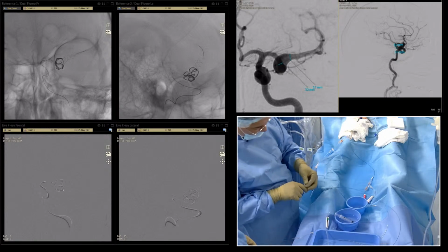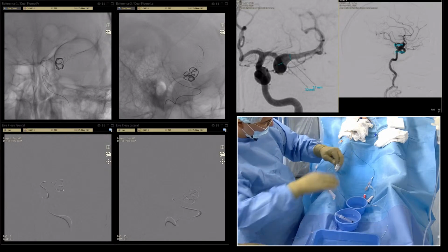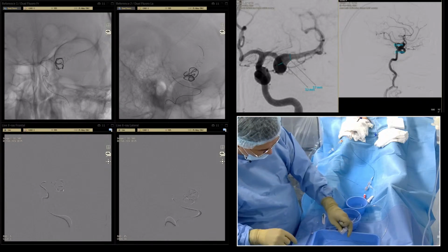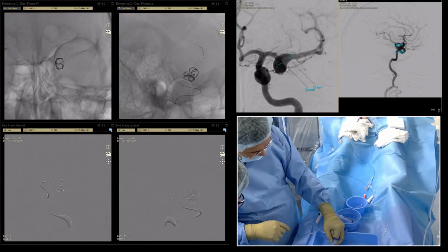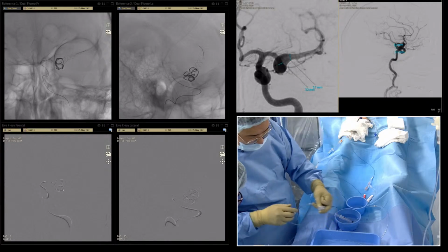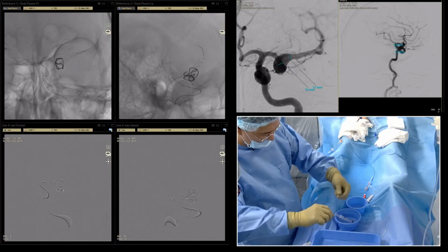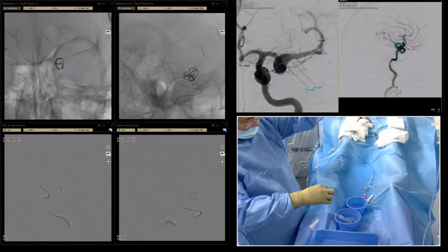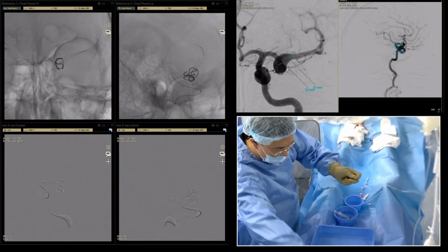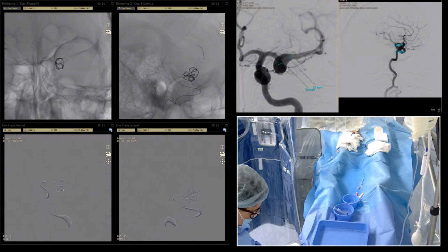What's this? It's impossible to push. Oh, it's detached. Okay. What can we do next? The coiling is not a good idea with Narrow Slider. Yes, it's quite a stiff device. Okay. Let's leave the last coil on the table. It's too stiff, huh?